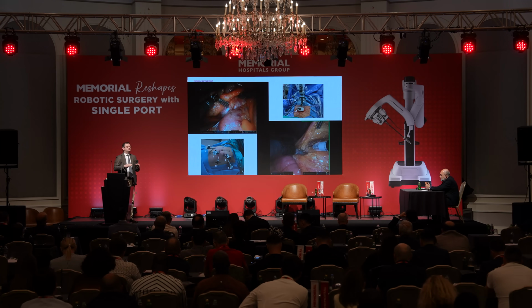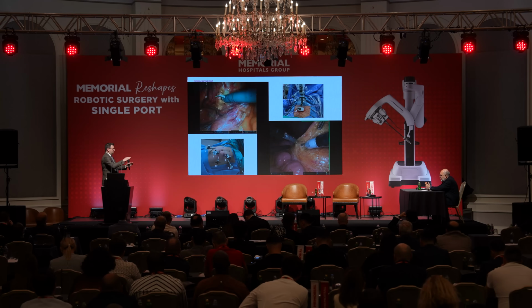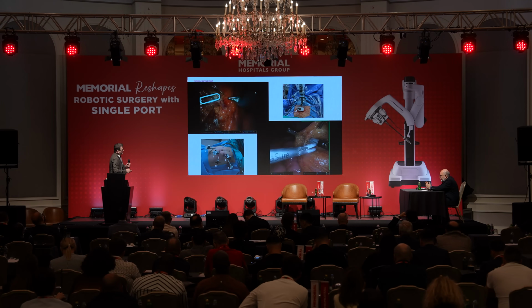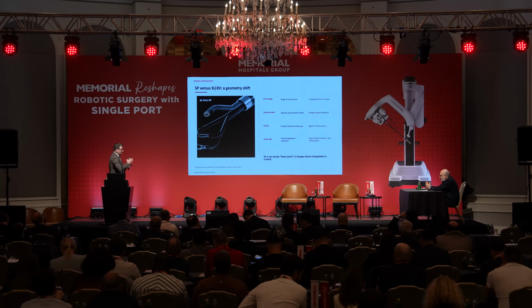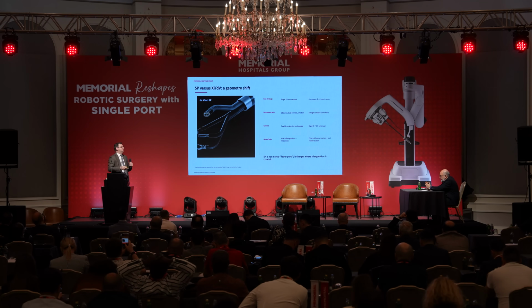You can reach any part of the abdominal cavity, but the approach that we used in the multi-port strategy changes. You need to do proper dissections in the small triangulation area, and there are differences not only in port number; the camera is different, as Sherief mentioned very well, and the instruments are not as thick as in the multi-port approach.